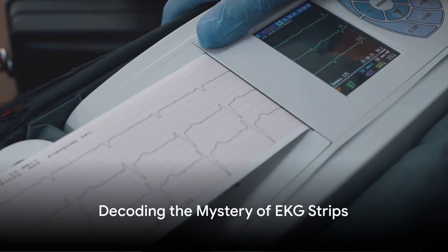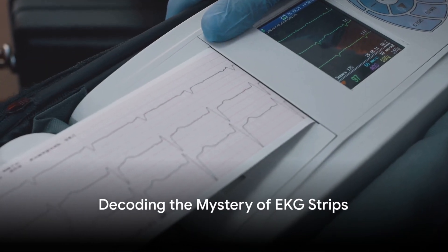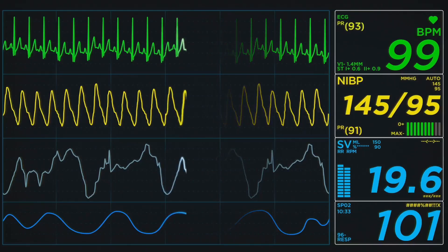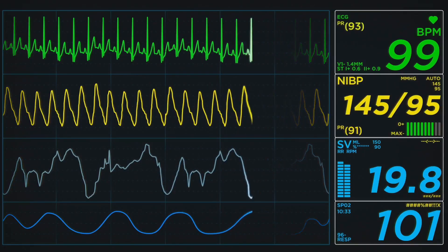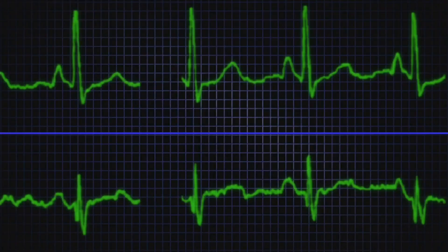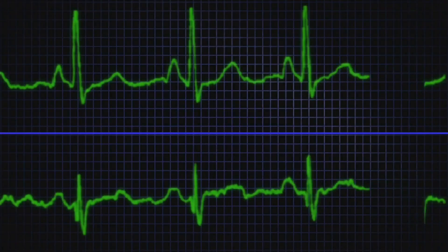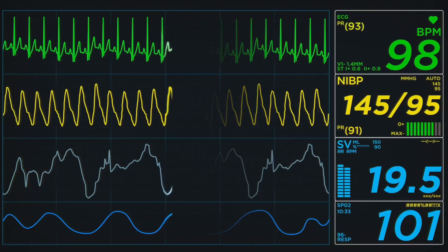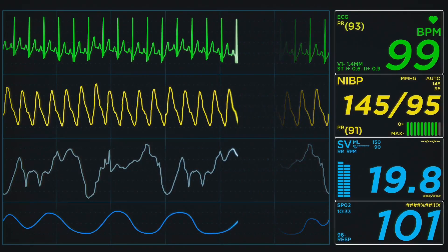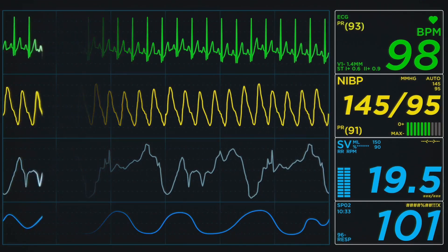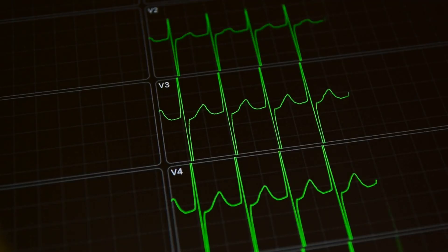Ever wondered how to analyze routine EKG strips? This question is not just for the curious minds out there, but also for medical students and cardiac nurses who engage with these life-saving tools daily. To correctly interpret an EKG strip, there are four basic criteria that need to be evaluated: the heart rate, the QRS complex, the presence of P waves, and the relationship between the P waves and QRS complexes.